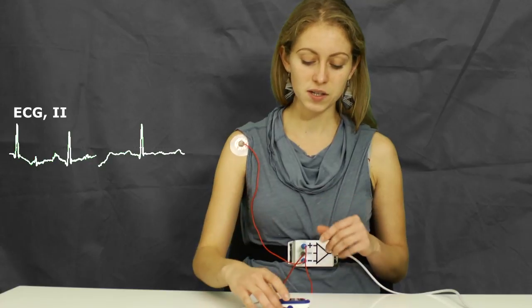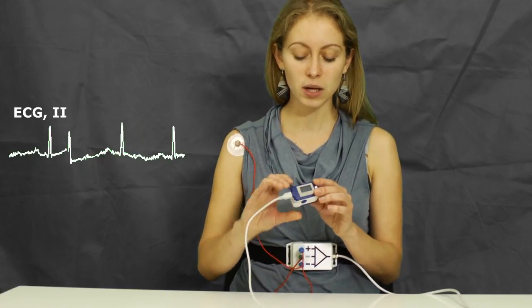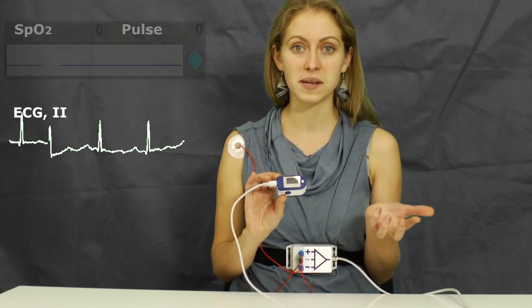If we wish to measure specifically pulse, the alternative way of doing this is to use this device here called a pulse oximeter.